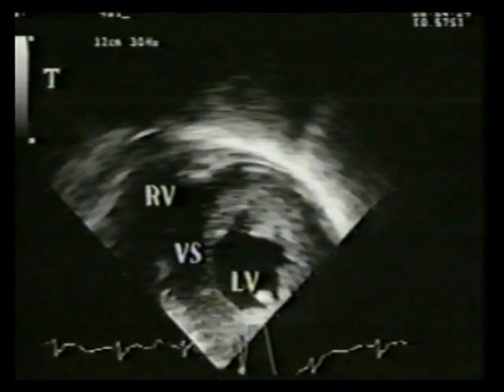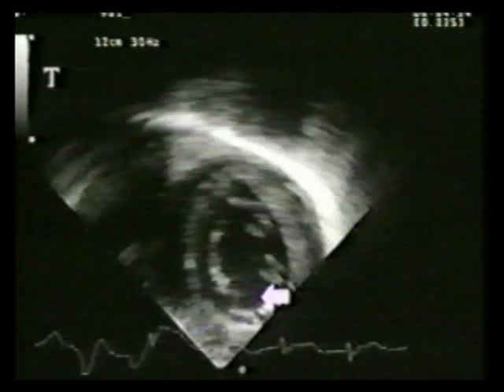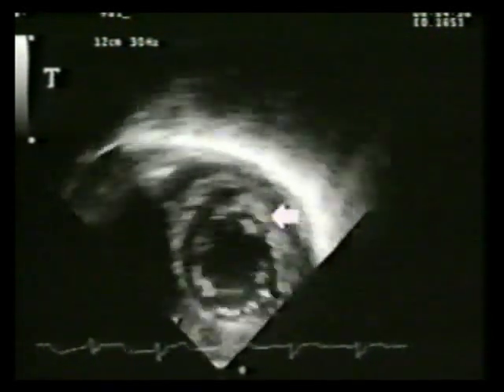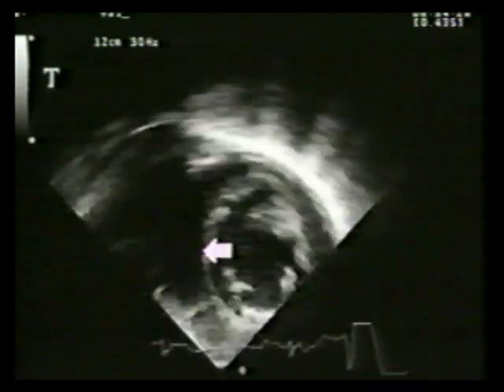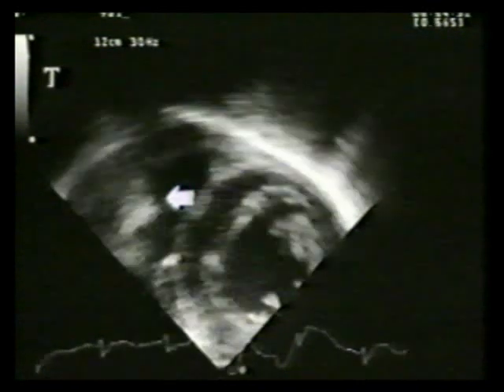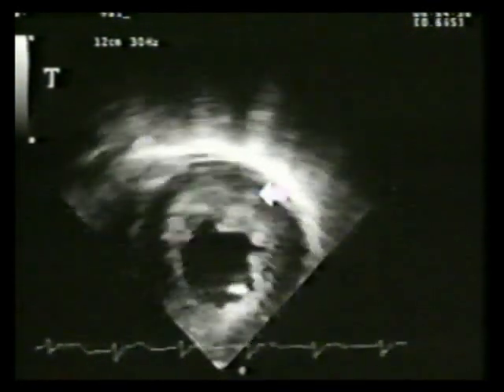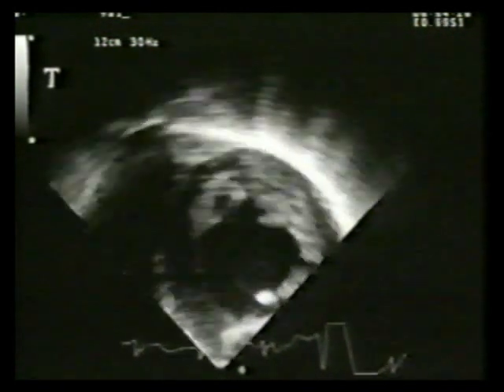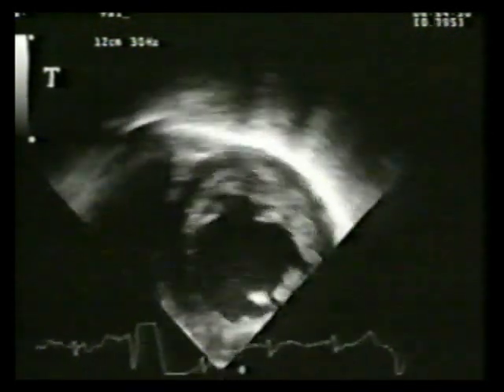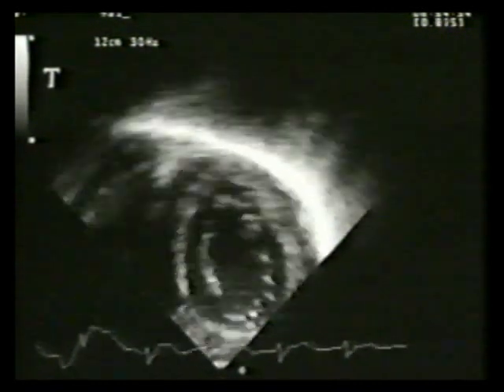In order to obtain this preferred anatomic orientation, the transducer artifact is imaged at the bottom of the screen. This is adjacent to the posterior wall of left ventricle. The posteromedial and anterolateral papillary muscles are viewed from apex toward base. The ventricular septum and right ventricle are to the left of the image. The anterior wall is furthest from the transducer. This particular view is used to monitor left ventricular function during high-risk cardiac surgery.